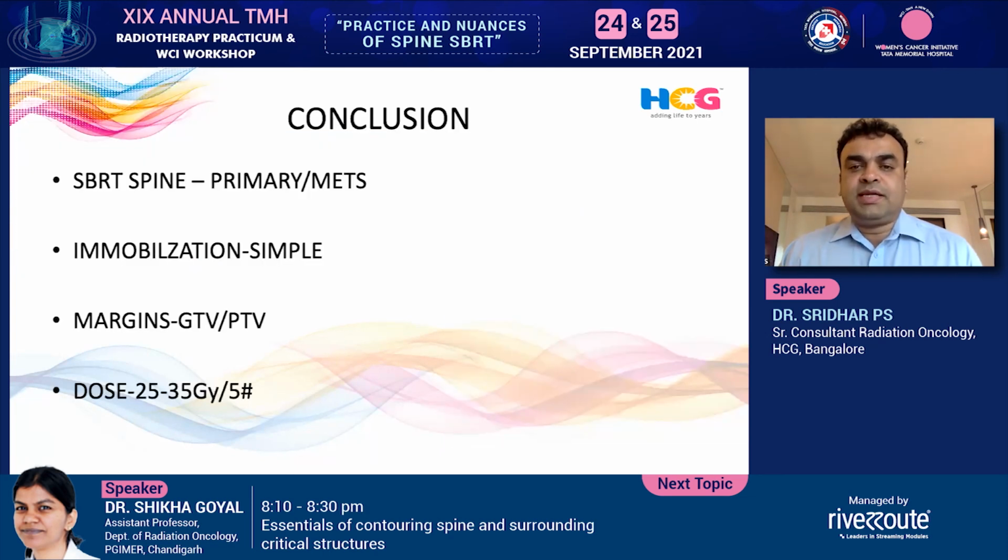For SBRT to the spine, if you want to start any SBRT program, spine is the best one. Start with the palliative cases and single versus 5 fractions, and that gives you more confidence. Use the immobilization device which is available with you, and if all the attachments are available, you can use it. But with experience, I feel that patient comfort is the most important thing, and the Vaclock is what I usually use, or maybe simple foam.